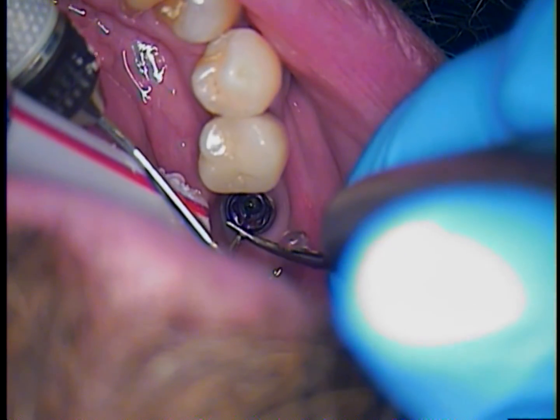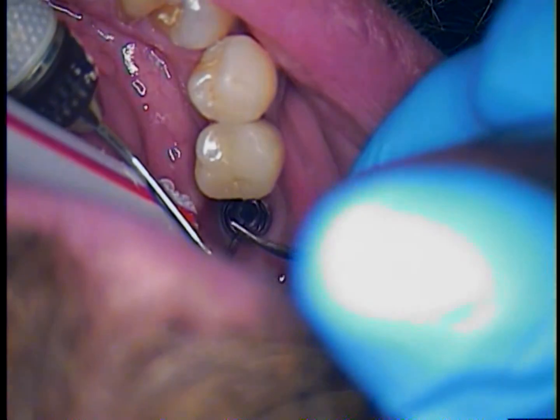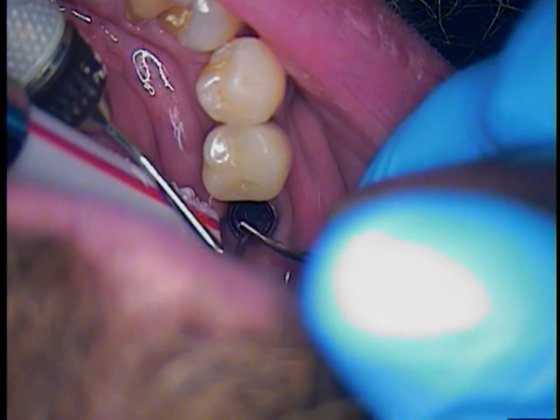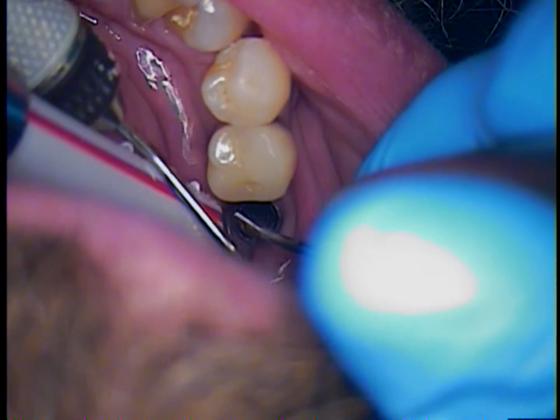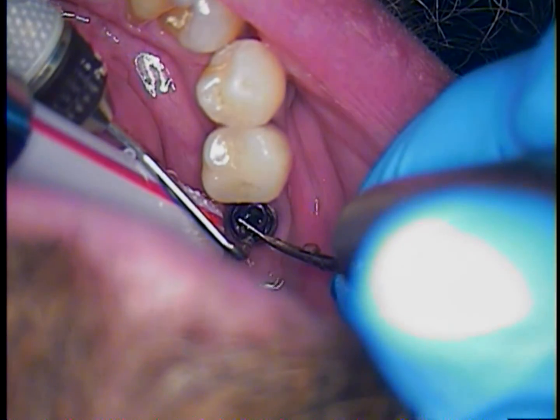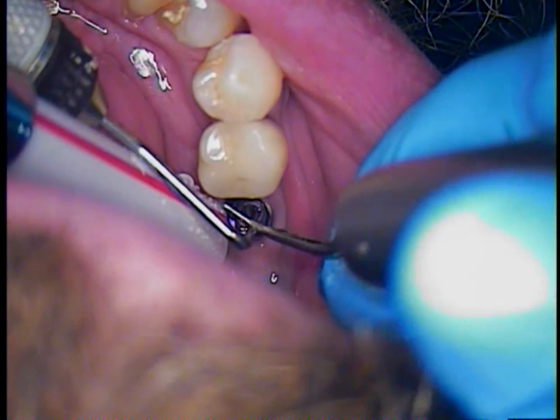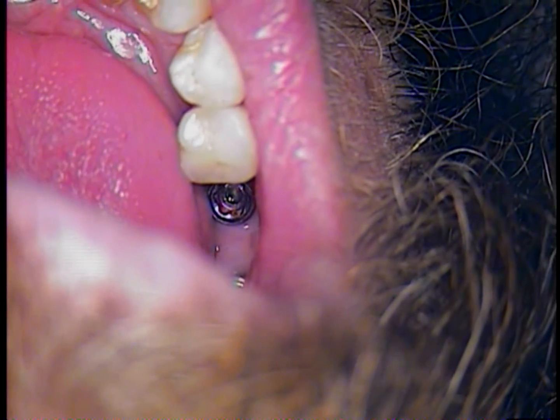I'm agitating right now using the ultrasonics. The ultrasonic I'm using is from a Cabo Sonoflex — it also has a fiber optic on it so I can see what I'm doing. I'm moving the periodontal probe and using the ultrasonic at the same time. I believe there's going to be a point where I'll go directly with the ultrasonics later on.